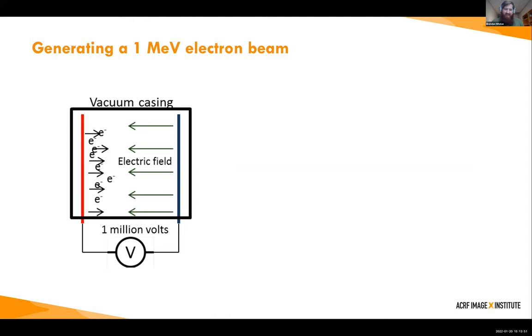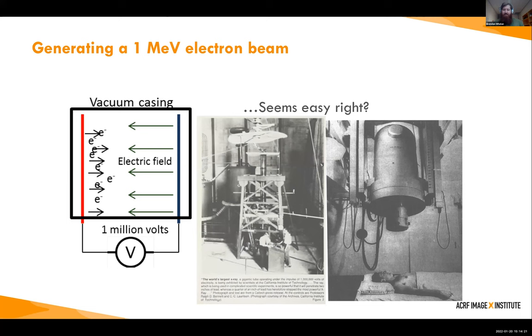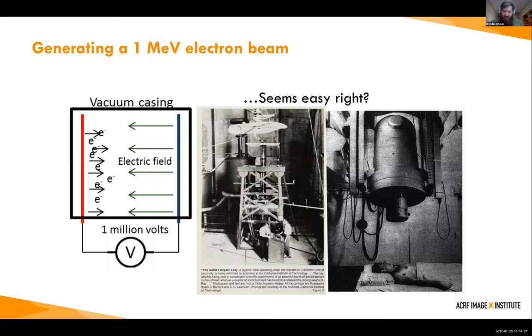A fair question is: if electrons traveling through an electric field gain energy, why not just use a higher electric field to make a stronger beam? To produce a 1 million electron volt beam all you need is a voltage of 1 million volts, and that's exactly how the first electron accelerators worked. These are some of the first accelerators to achieve 1 MeV — absolutely massive devices, four or five stories high with two people visible at the bottom. Today we produce an electron beam six times stronger than that using a device only this big.